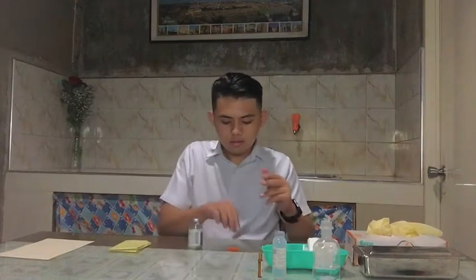Invert the vial, ensure the needle tip is below the fluid level, and gradually withdraw the medication. As I have said earlier, we will be withdrawing 50 units. Then you can also tap this one to avoid some air. Next, after this, place the cap. Place it here.